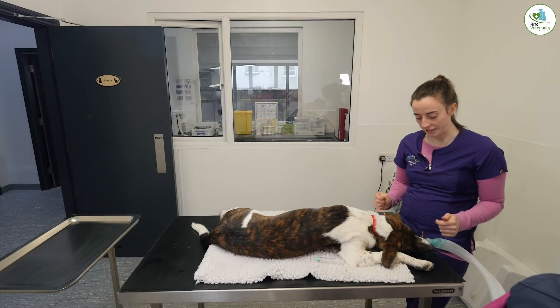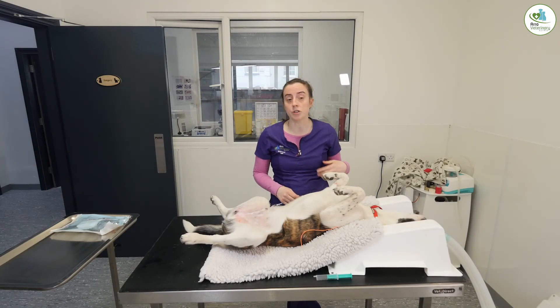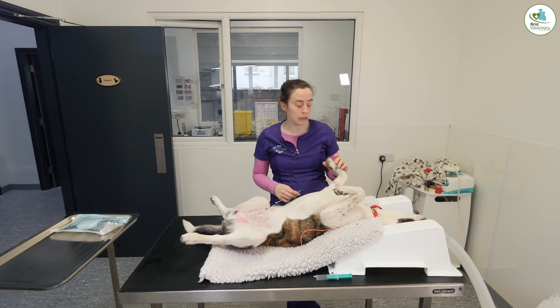The next step is to get myself prepared for surgery. We also give the dogs an anti-inflammatory injection as a painkiller, and an antibiotic as well.